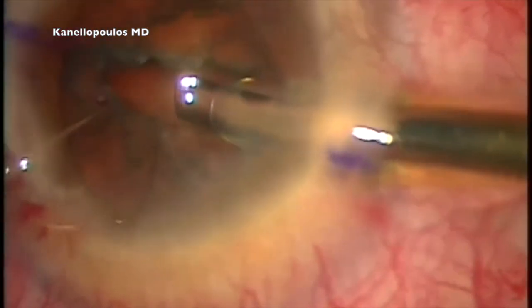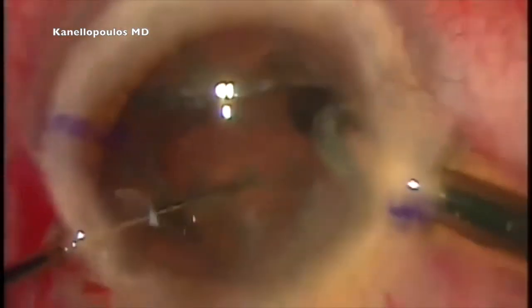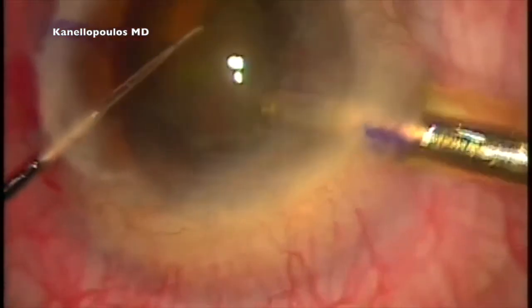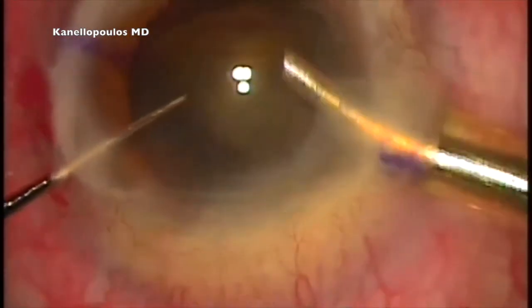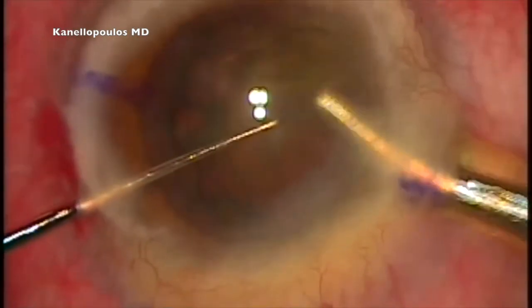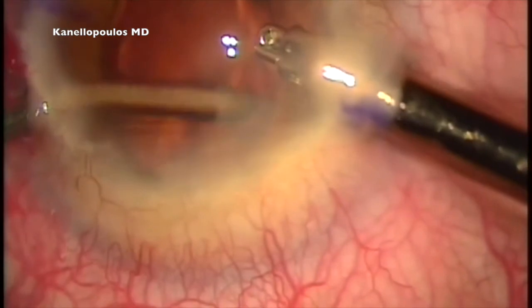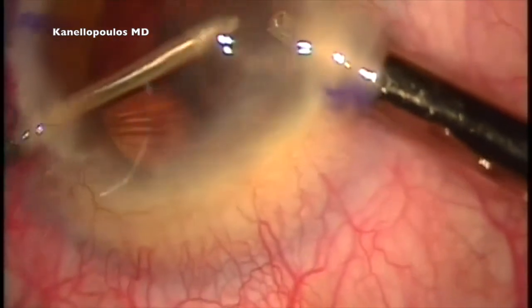Nothing really challenging here despite the fact that the superior cornea is quite cloudy. I'm using my Sinskey hook to elevate the globe a little bit to enhance my red reflex. One-handed capsulorhexis, and now our divide-and-conquer technique of nucleus disassembly. I'm going to use the central groove with the Signature phaco device, crack in half. Since the lens is not extremely hard, I'm going to just engage and pull up each hemi-meridian of the lens and complete the cataract surgery. Always viscoelastic in the anterior chamber to maximize endothelial cell protection — at this stage it's not unusual that I'll use three tubes of viscoelastic. I know it's a large expense, but a great lifesaver for endothelial cells. Using my split irrigation-aspiration device — you can see the tip is also diamond-dusted — in order to polish the posterior capsule if needed.